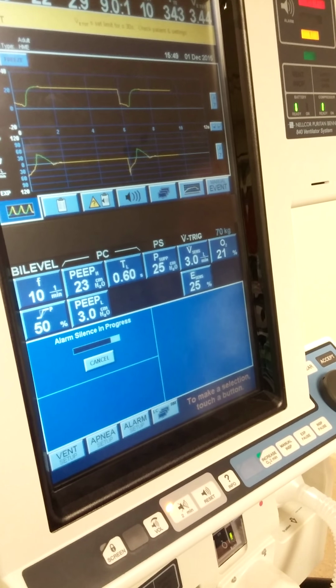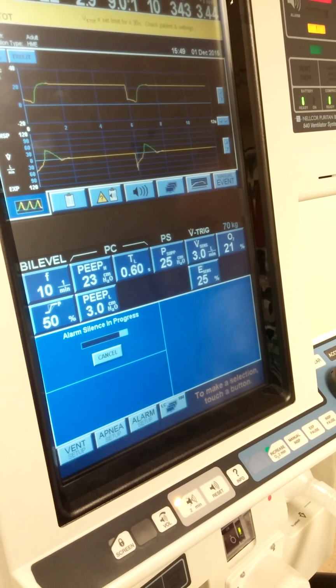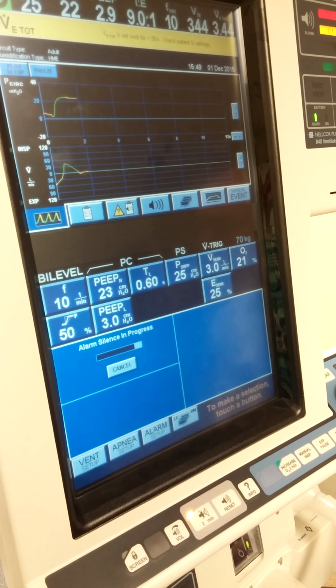When do we use APRV? Or when do we use bilevel? Bilevel.